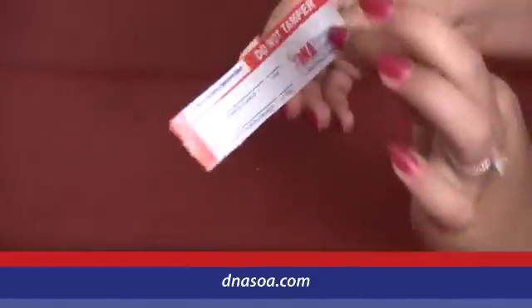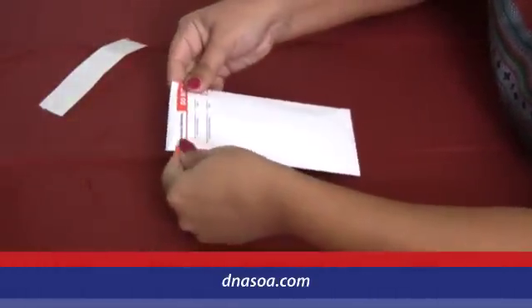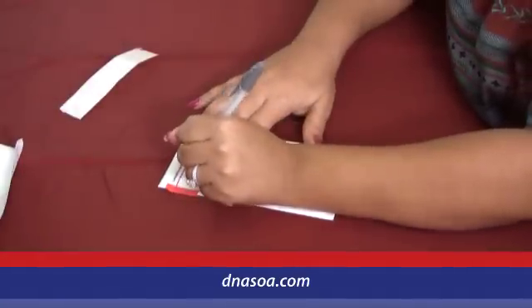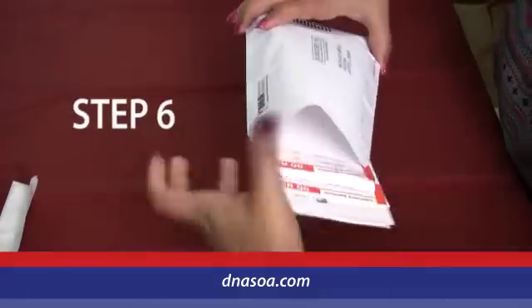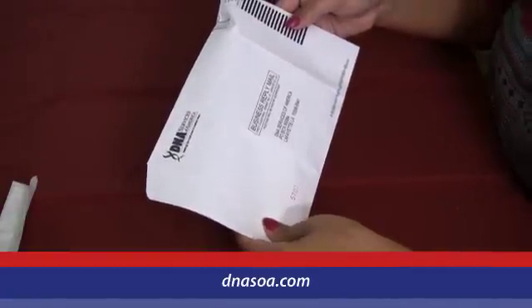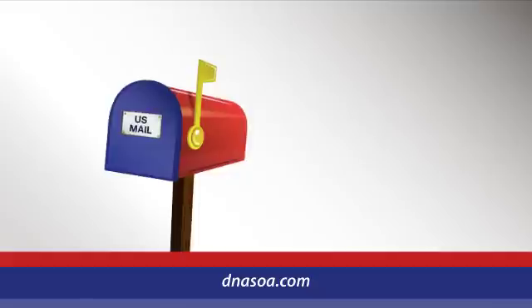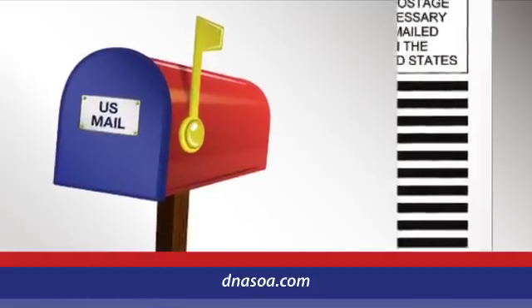Step 5: Seal each envelope with the tamper-proof tape provided. This way, the laboratory will know that no one has tampered with your samples. Step 6: Place all sample envelopes and the order form into the postage paid shipping envelope, seal it firmly, and simply send it back to us via U.S. mail. No additional postage is required.